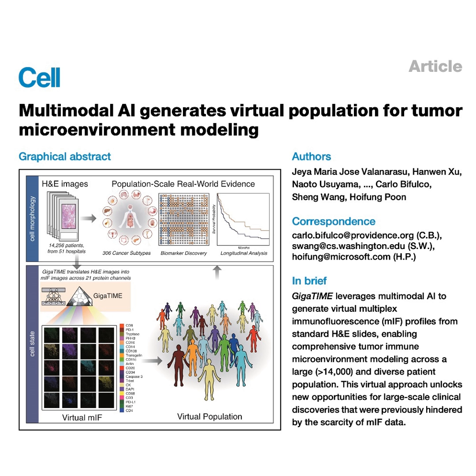It likely points to a coordinated, active immune attack. The plasma cells are producing antibodies, and those antibodies are flagging the tumor cells for the macrophages to come in and destroy them. So you're not just seeing 2 cell types present, you're seeing evidence of them working together. You're seeing the signature of a functional, organized immune assault. We saw similar synergies with other pairs, too, like combining the immune evasion marker PDL1 with the cell death marker caspase-3. It's all about capturing that interplay.